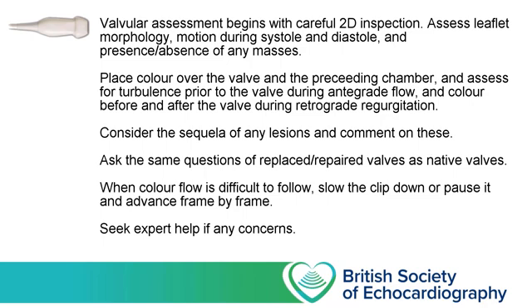And if you're ever uncertain, pause your image and advance one frame at a time, paying attention to which phase of a cardiac cycle you're in to help you understand where flow is going. Valvular assessment is challenging, and it's expected that for most valvular lesions, you'll need to seek expert help of a level 2 sonographer to further characterise that lesion.